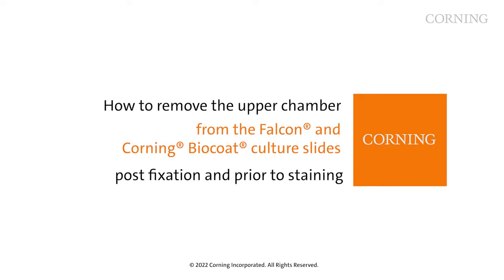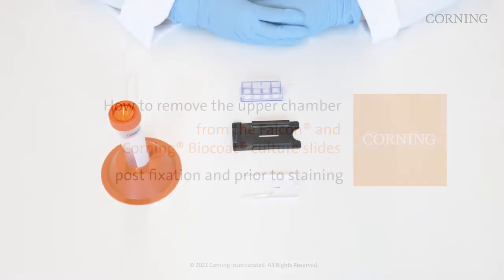This short video will demonstrate how to remove the upper chamber from the Falcon and Corning BioCoat culture slides post-fixation and prior to staining.